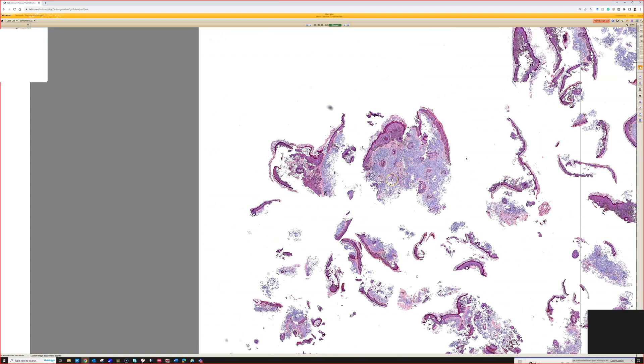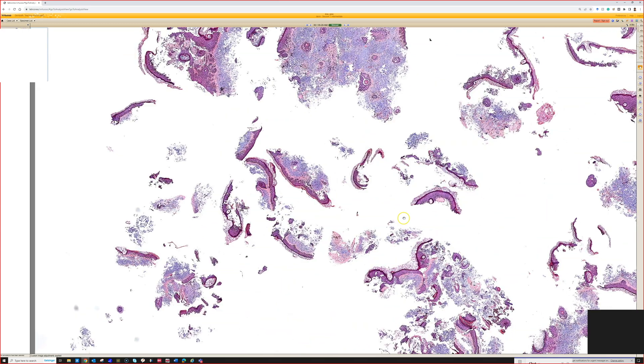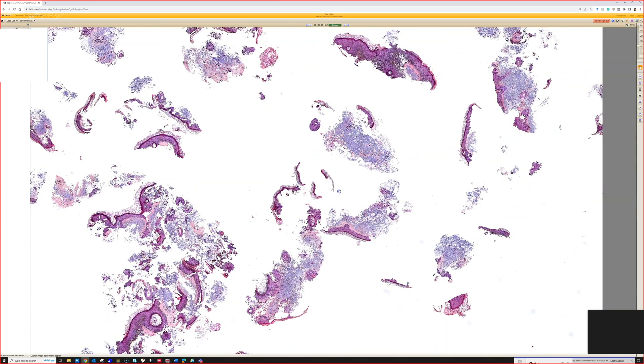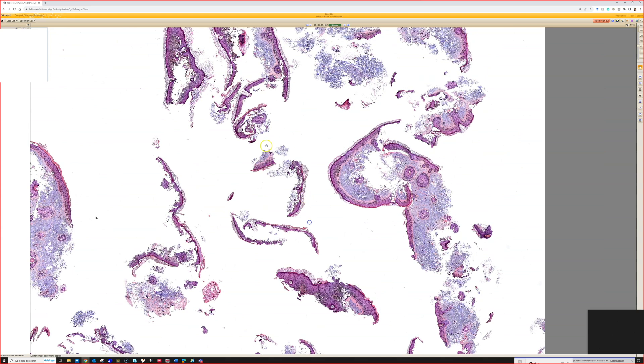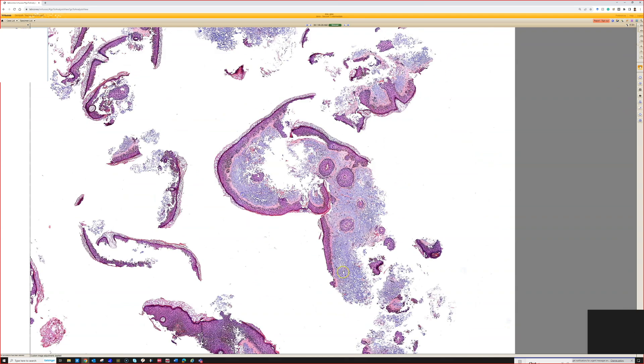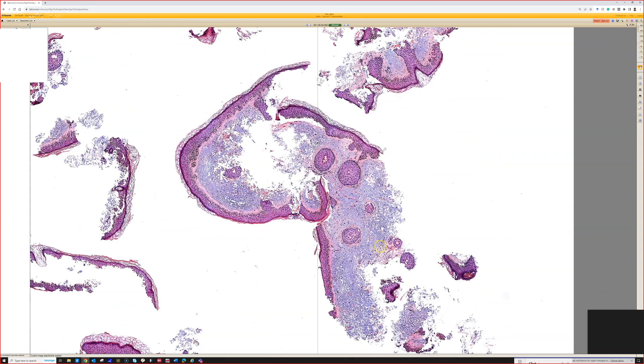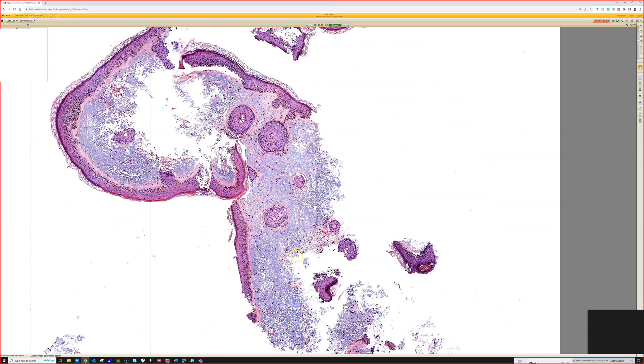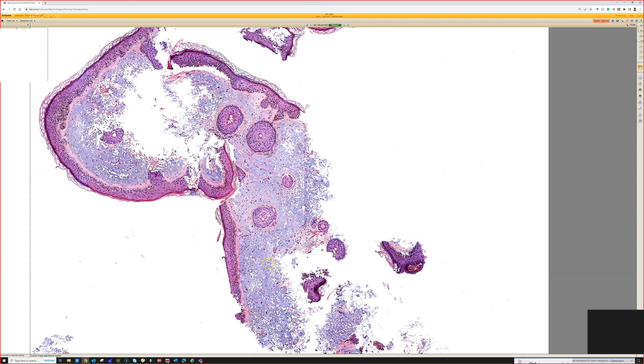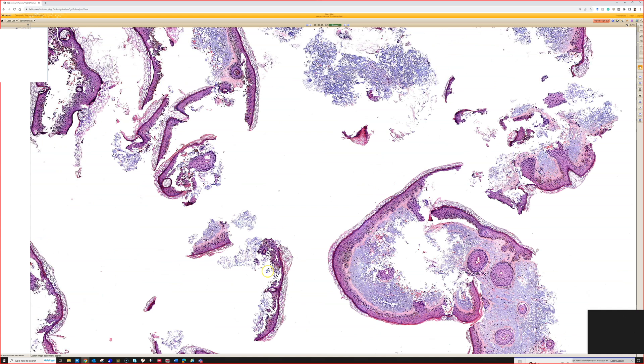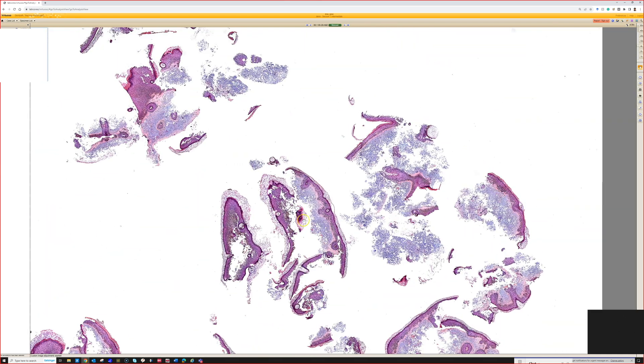Oh, nightmare scenario, right? These are, for anyone who has not seen this kind of specimen before, all of these fragments of skin from a sun-damaged old person. Look, the dermis is totally blue because it's completely replaced by solar elastosis. But these are multiple fragments, and the reason it's fragmented like this is this was curetted and removed with a sharp scraping curette.